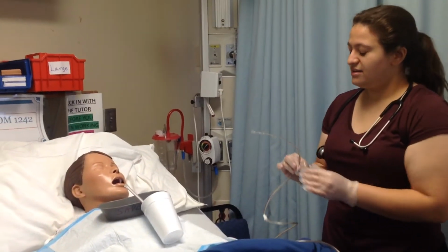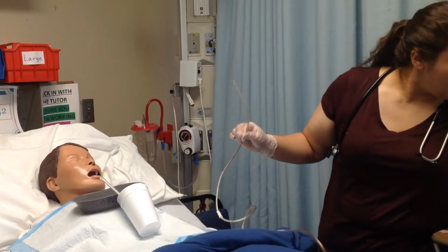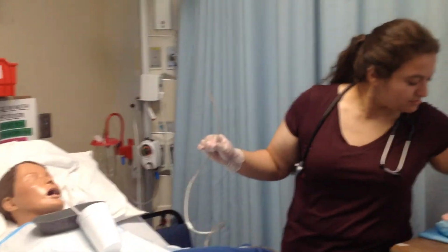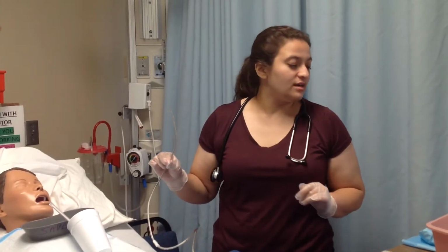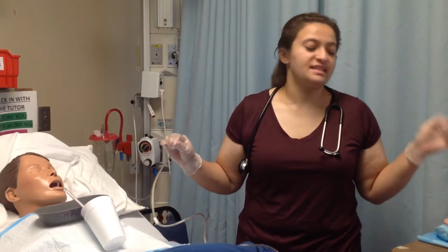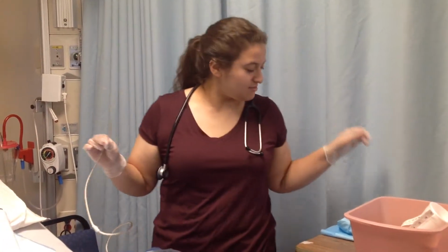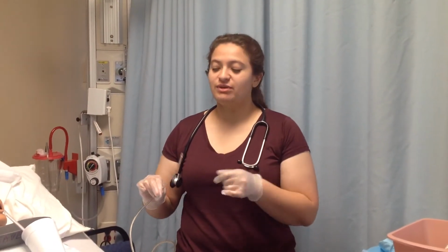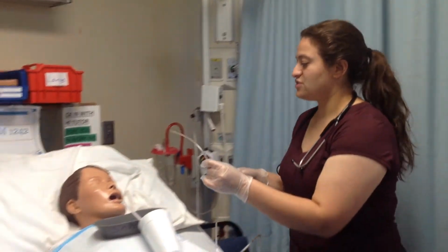So once I've done that, then I would go ahead and take my lube. I don't actually have any because we're not supposed to put any in the mannequins. So I'm just going to verbalize that I would take some lubricant, and I would have a package. I would make sure to open it and lubricate the tube at least 1 to 2 inches, just to facilitate the tube once it goes down the patient's nasal passage.